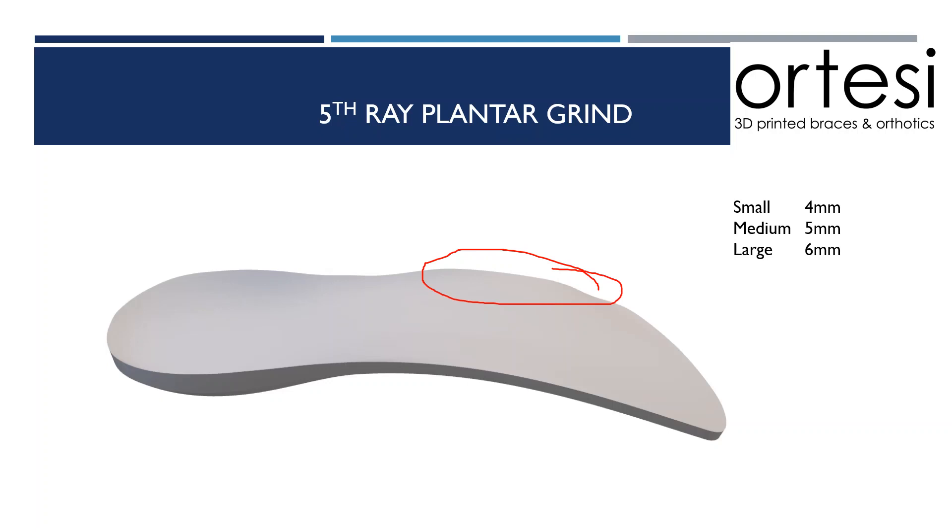Adding valgus correction to an orthotic has been shown in the literature to reduce the load on the plantar fascia. So this might be a useful modification for a patient suffering with plantar heel pain.